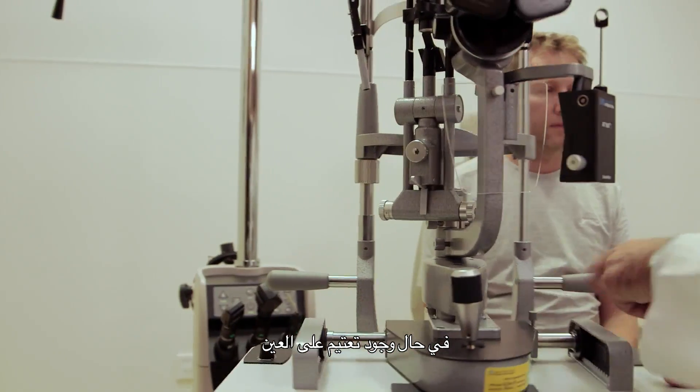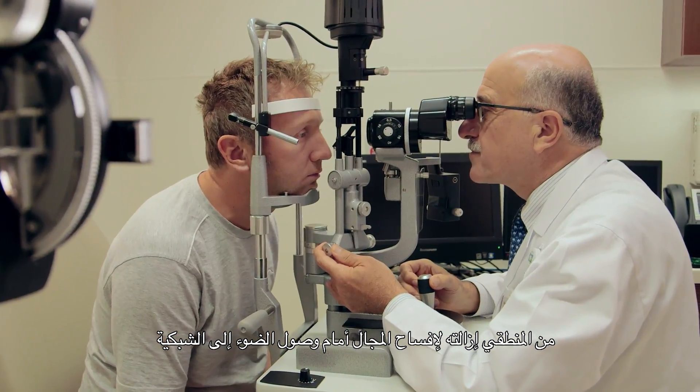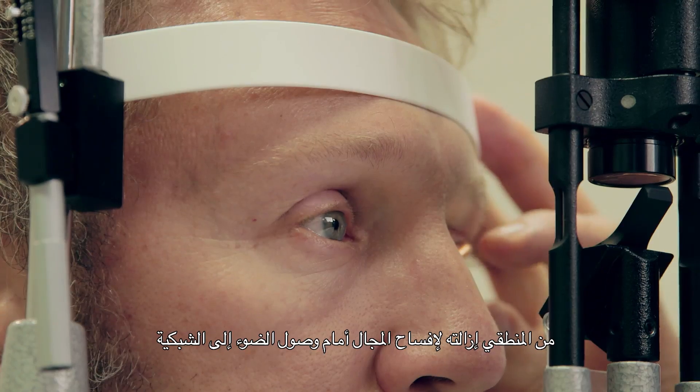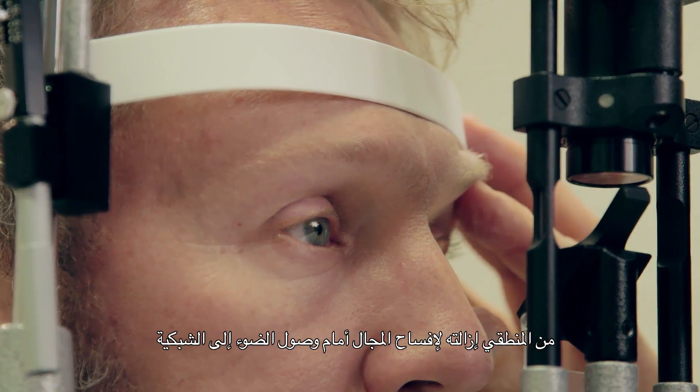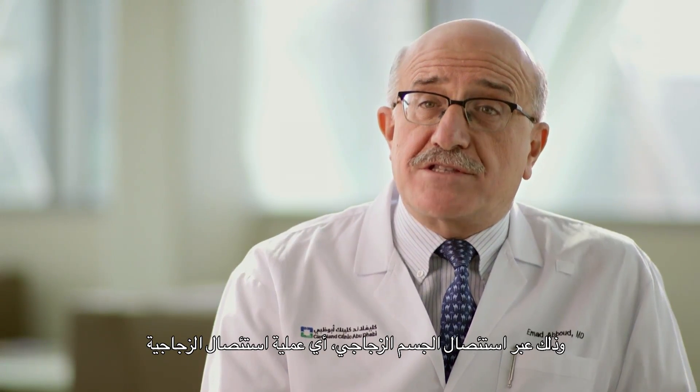Because there is an opacity inside the eye, the logical thing is to remove it to clear the way for light to reach the retina. The way to do that is the removal of the vitreous jelly, and this is what we call vitrectomy.